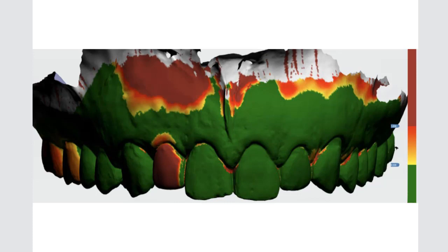Of course, one can ask, Nelson, how about the differences in scanning when you're scanning? Yeah, you can have some tissue more stretched than others. You can have the frenum position to the left and to the right. This is something that we are trying to work around now using artificial intelligence somehow. But anyway, what matters is where you have scans that really match the previous ones, for instance teeth, areas, papillas surrounding the teeth. Those are very static, or not static, I would say, but they are very good references for planning.